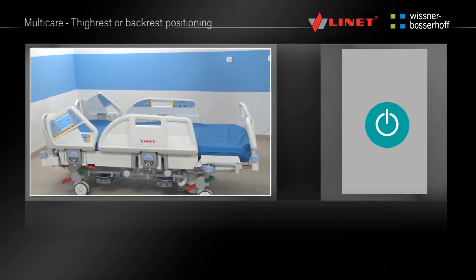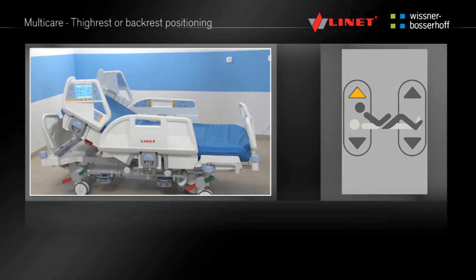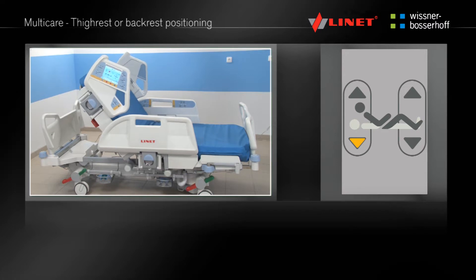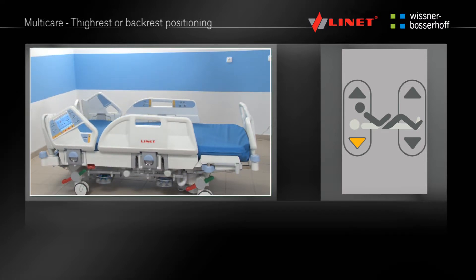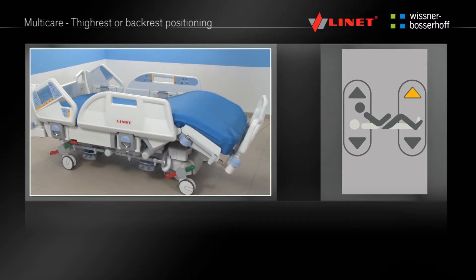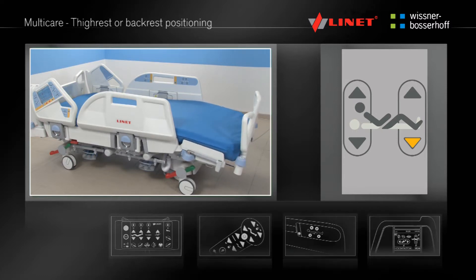Activate the function by pressing the Go button. Press and hold the function button until the desired angle of the thighrest or backrest is reached. This function is located on the Multiboard, Supervisor panel, handset and the integrated side rail controls.